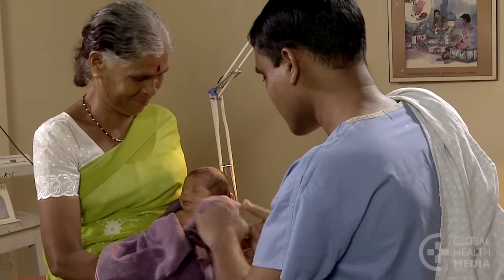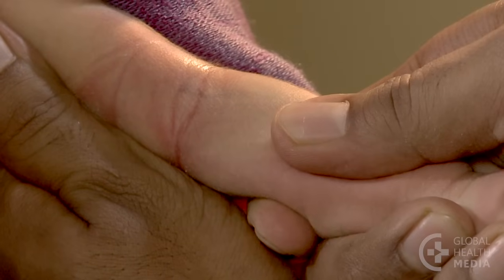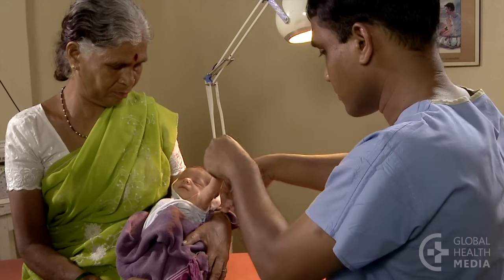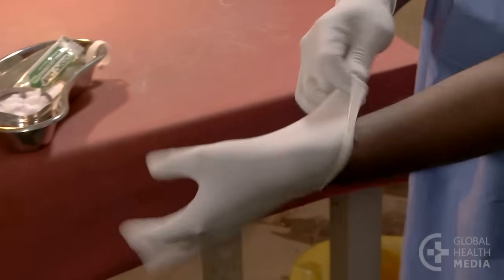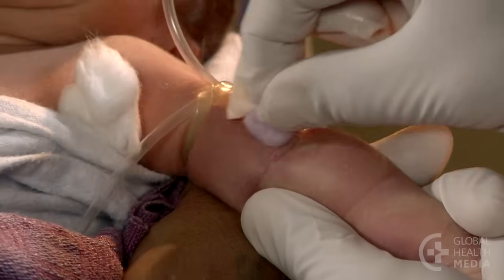Here we draw blood using a sterile needle and syringe. Find a good vein, then tie the tourniquet so you can easily release it. Put on your gloves, then clean the skin well three times.